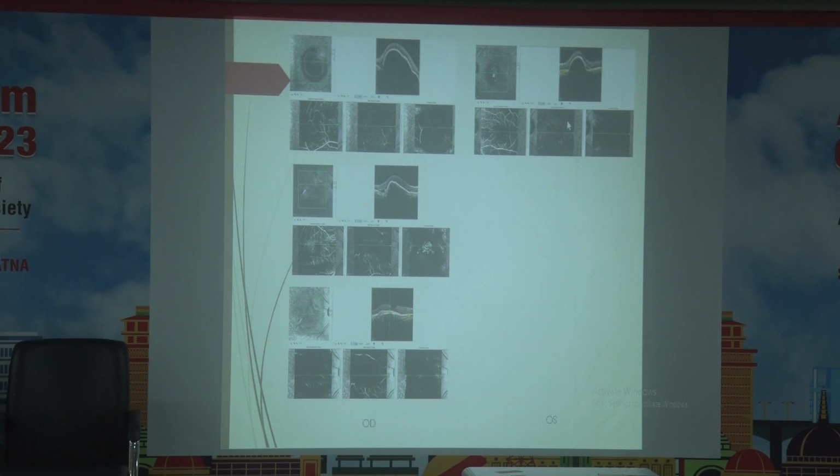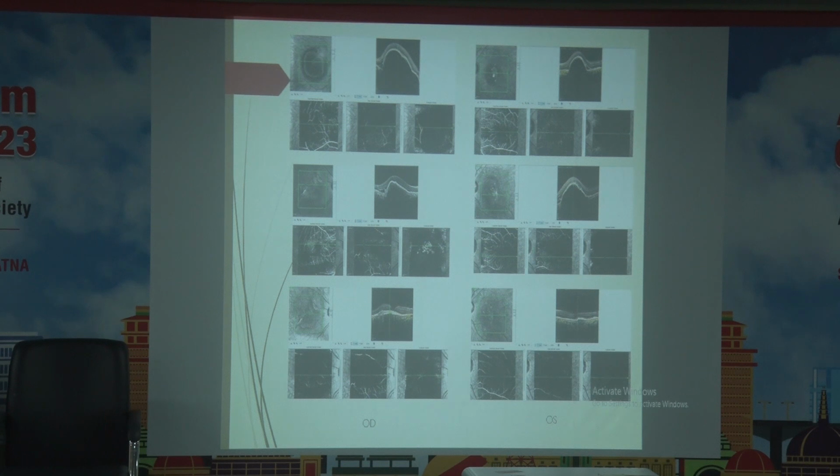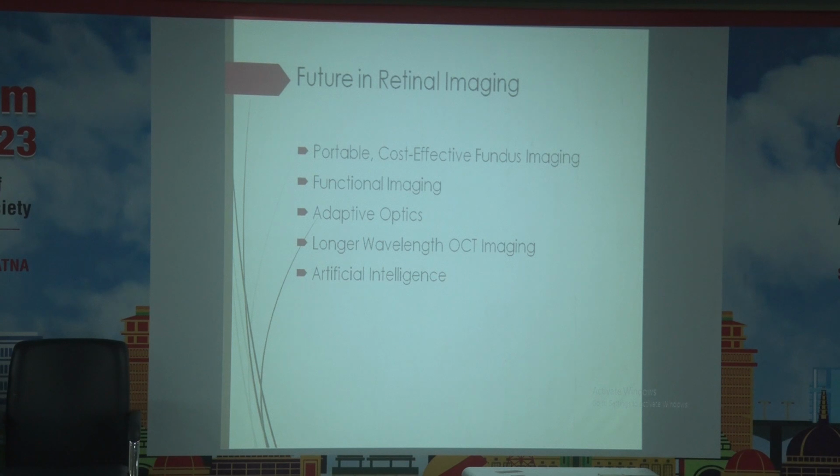The retina was flattened, as well as the RPE detachment. The other eye also showed an ill-defined halo of fluorescence below the RPE detachment, and this was also treated with anti-VEGFs, and you can see the flattening of the retina and the RPE detachment. So we should do a real-time angiogram to detect all the lesions, so as not to miss any other peripheral lesions in the posterior pole.